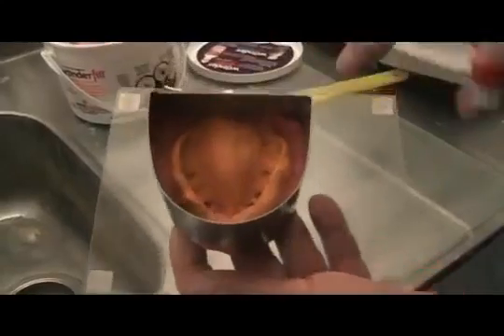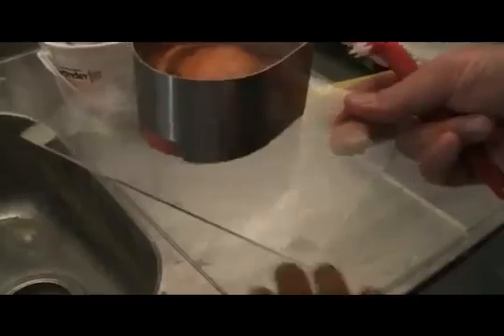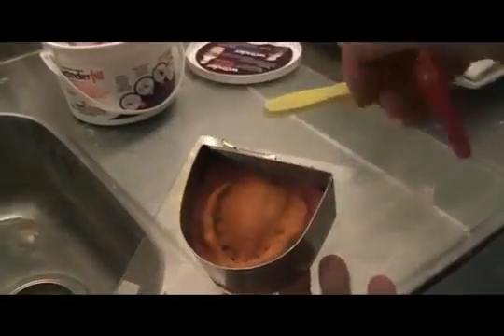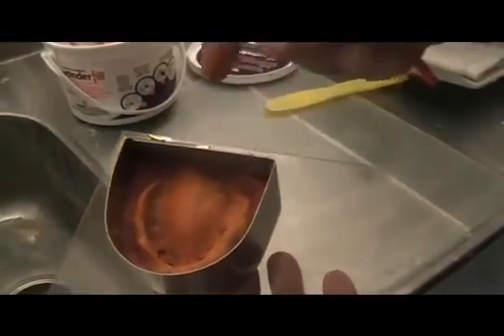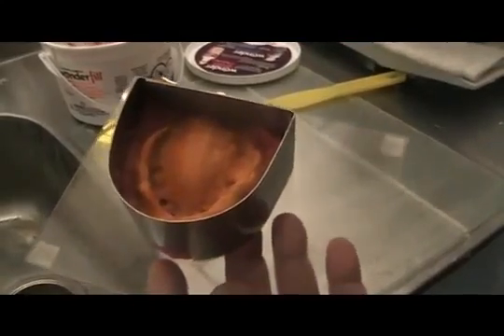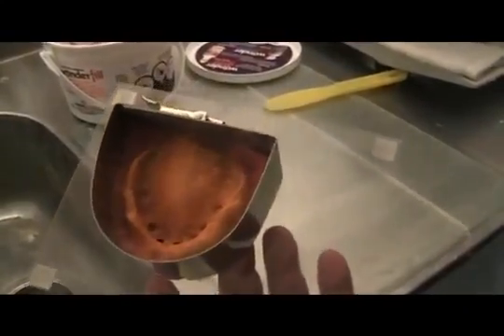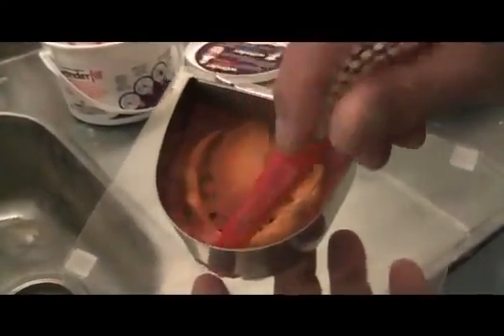And again, we'll pour this up. I'll pour this stone into this, and then I'll take this whole piece of plexiglass and vibrate my stone in. Once it's set up, I'll undo this latch, open it up, take out my impression that has now been poured and the stone is hardened, and I will pull off and clean off the Wonderfill material. There'll be a little bit of stone in some pieces. Just pick it off and throw it in the garbage. That's basically where the consumability of the product is, just in cleaning it up in between each usage. This is a single arch application, but you could literally do this with as many as you wanted.